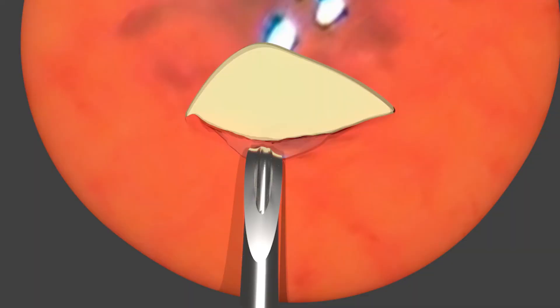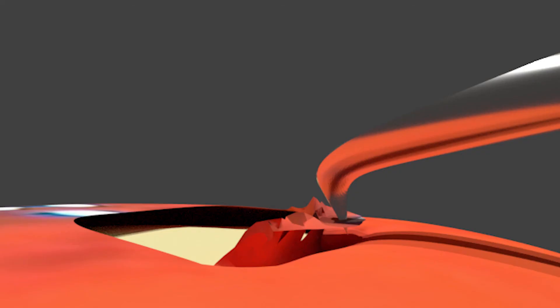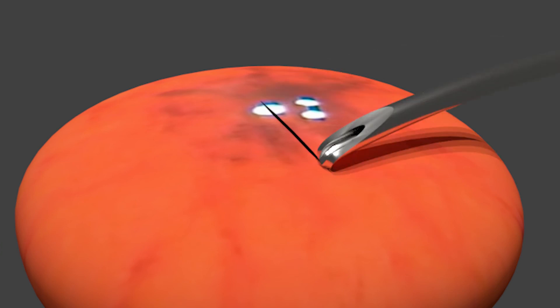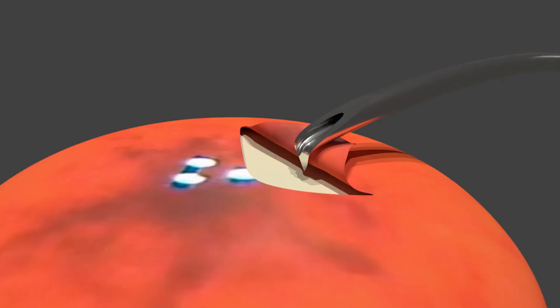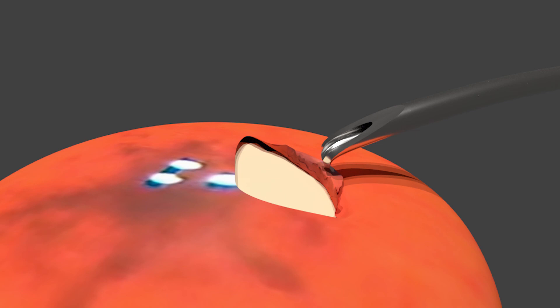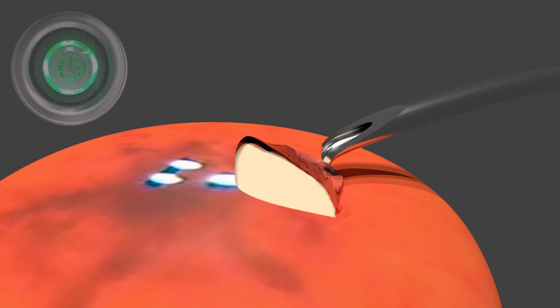We should go ahead and show you how it should be done. Here we have two views: the first from the top where you can see the cystotome properly engaging the flap, and the second from the side where you can see that it's down at an appropriate height above the lens surface. Let's wrap this up — here's the next-to-last image before the flap is created, and here's how it should have been grabbed to make it work effectively.